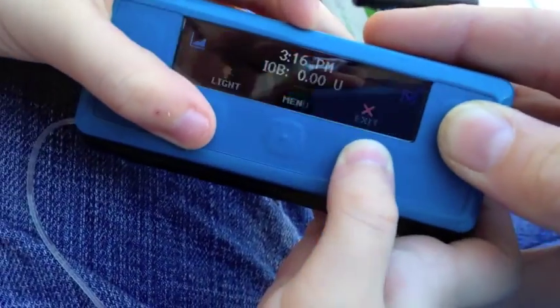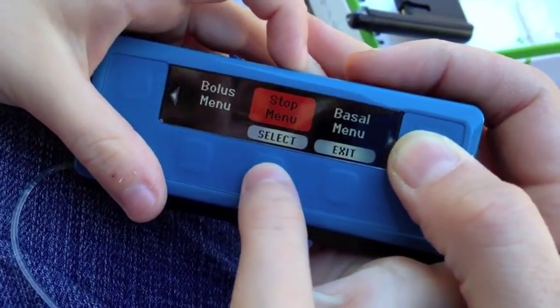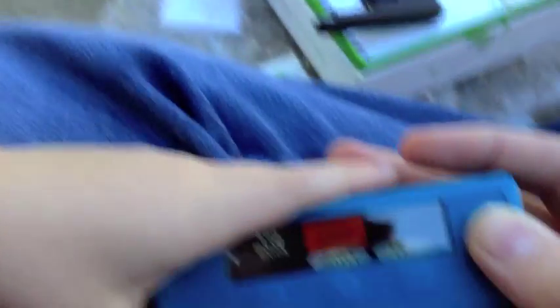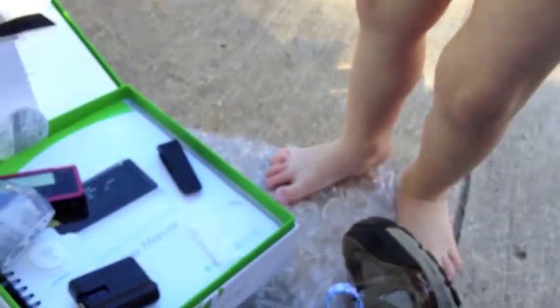The menu — we have a lot of the original features here. Can I look at the menu please? Bolus menu, stop menu, prime menu, basal menu, logbook, setup, press exit. It comes with fun bubble wrap for the whole family.